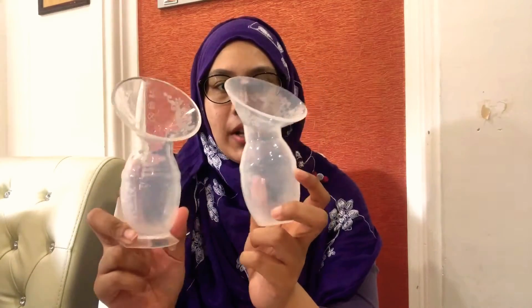They look more or less similar, but functionality-wise they are totally different. I'm going to jump straight to the conclusion: between these two, I prefer the Haakaa silicone breast pump because the silicone is more steady and firm. The Autumn one is too squishy and doesn't hold or press your areola — the surrounding area of the nipple — very well.